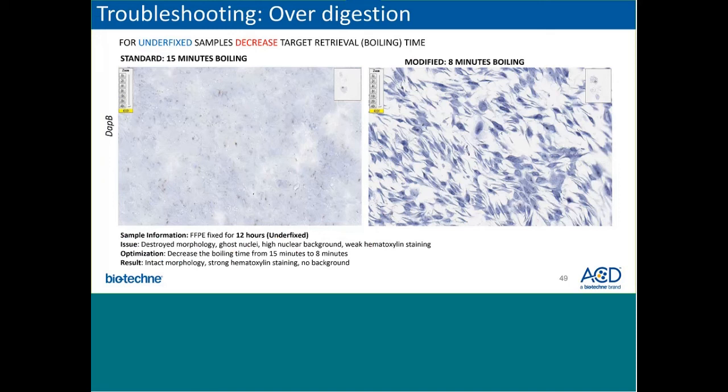So in order to optimize this, we've then decreased the boiling time from the standard 15 minutes to the modified 8 minutes, which is then seen on the right side. Here you'll see intact morphology, much stronger hematoxylin staining, and you don't see the background that was seen in the previous sample.